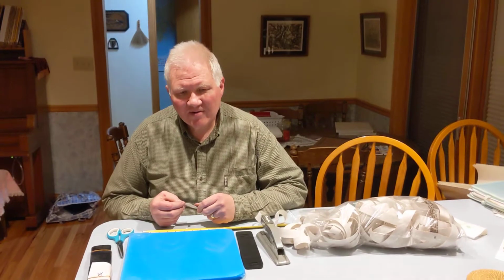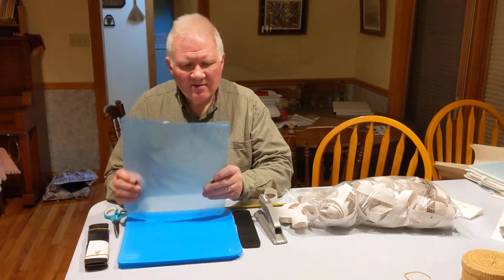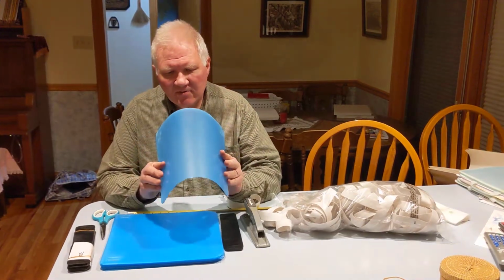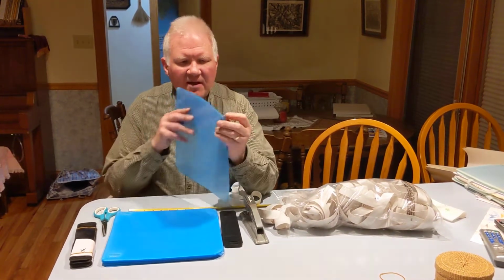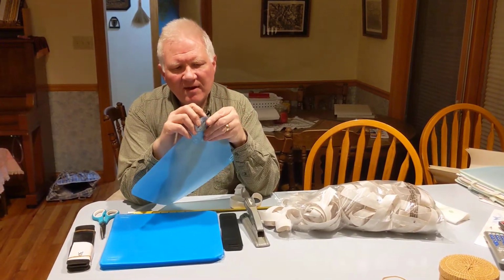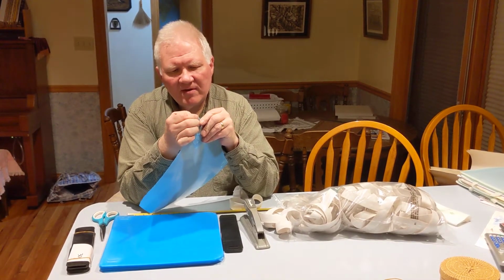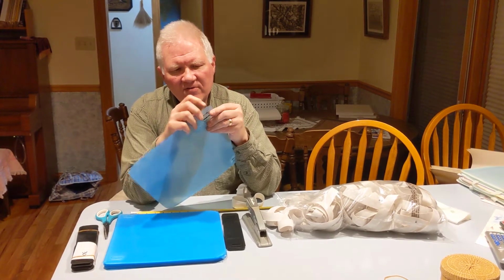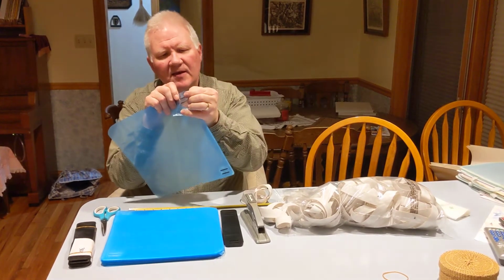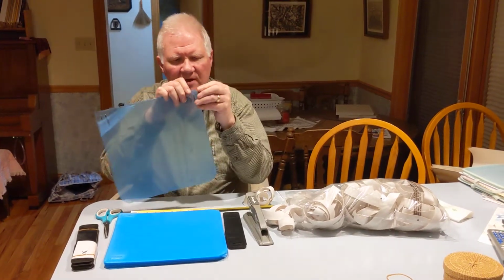I'm going to demonstrate how to assemble these face shields. This is a special type of flexible acrylic called PETG, flexible plastic. It does have a protective clear film on both sides. Actually, it has a bluish shade to it, and we want to leave it on, but we need to remove it. Just pull it down on the corners where it's been laser cut to allow the elastic to be attached. So just peel back the top corners on both sides.